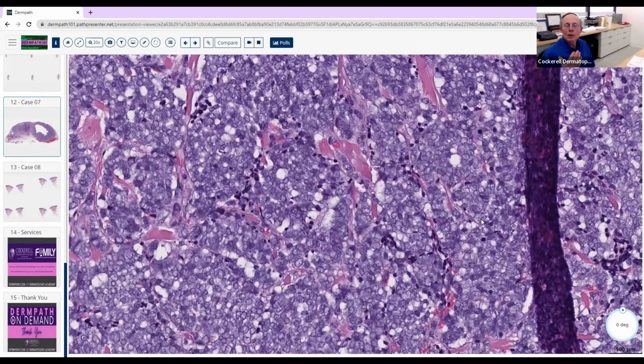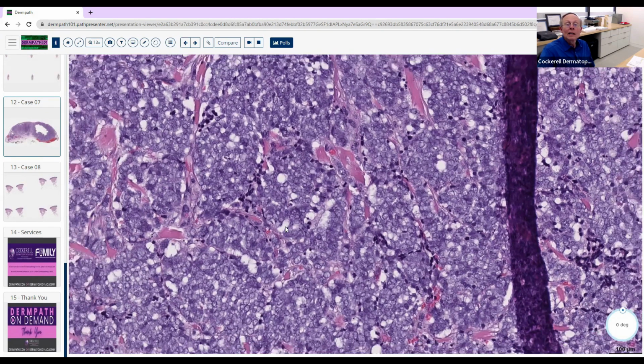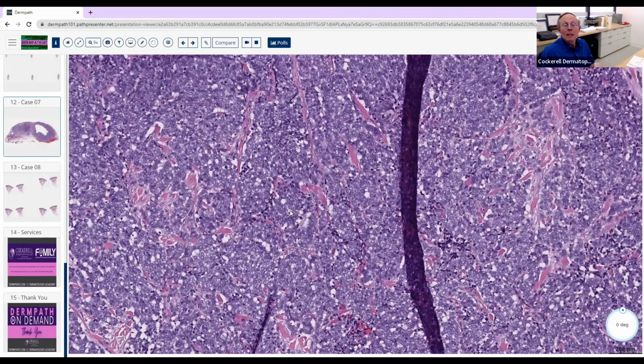And the other stains that we use for this are things like cytokeratin 20, and you get the characteristic paranuclear dot staining pattern. You can sometimes even see a little pinkish structure that actually represents that if you really look carefully. I'm not sure we see too much of that here, but that's what those look like. Synaptophysin, things like INSM1, those are the markers that we use to actually make this diagnosis.